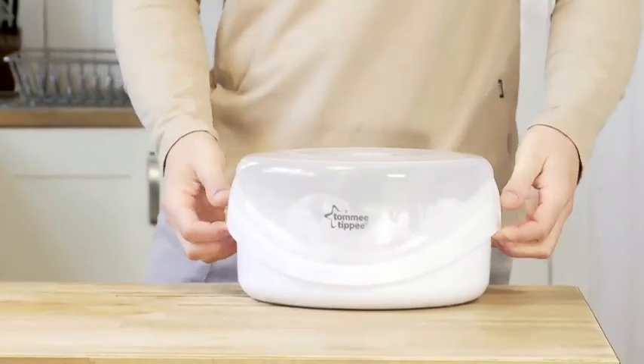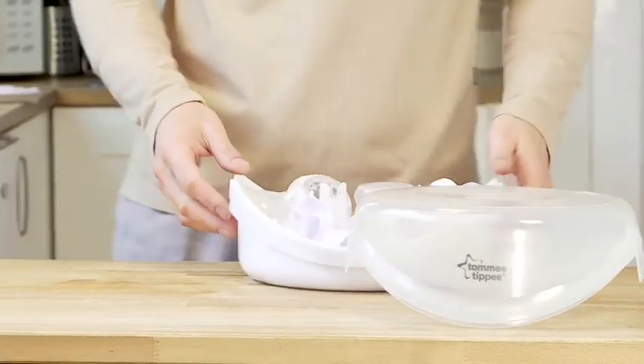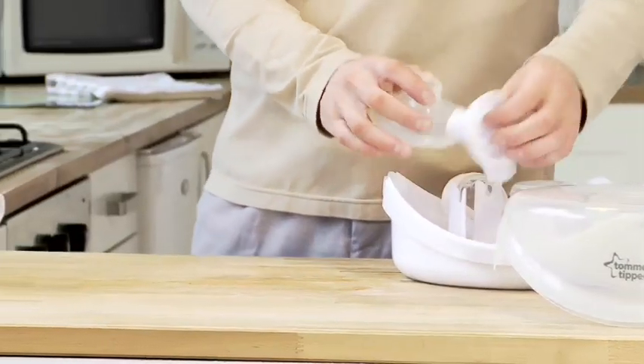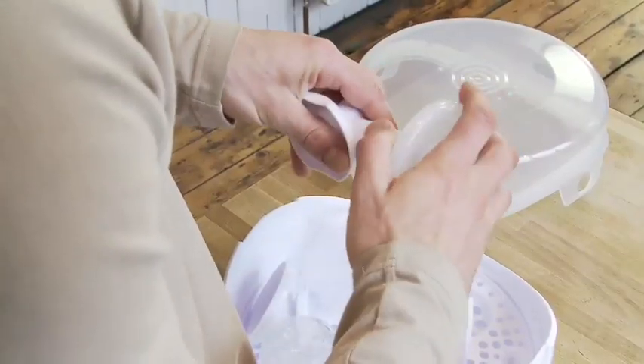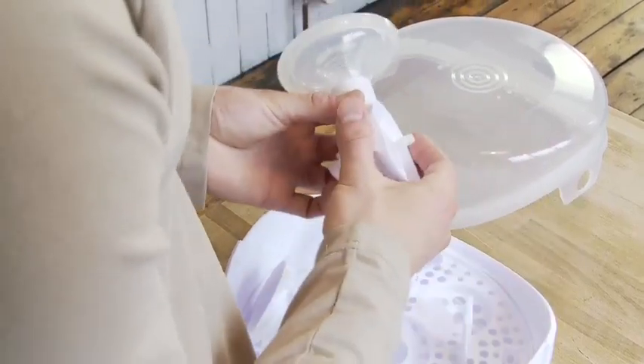Once the contact parts of the pump have been sterilised, you're free to assemble the device. The electric breast pump's intuitive design makes it easy to put together, but take care not to rush. Each component should align and fit securely.